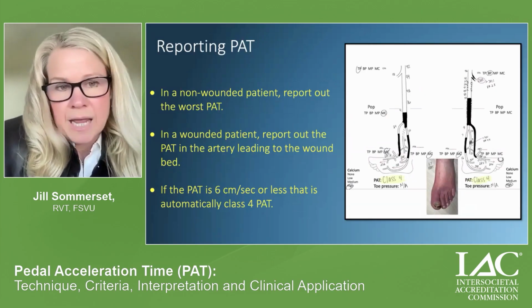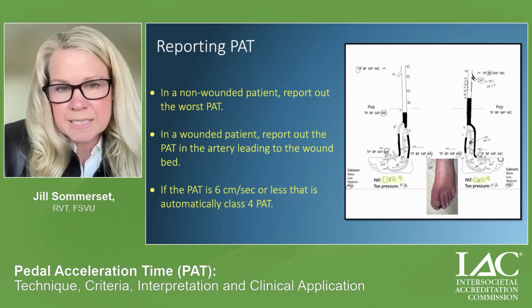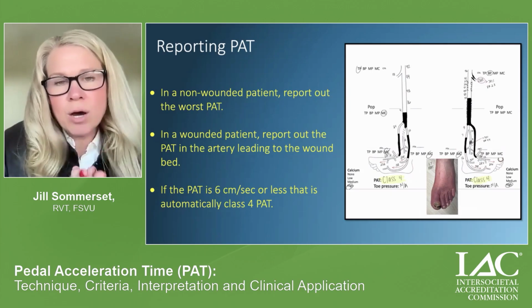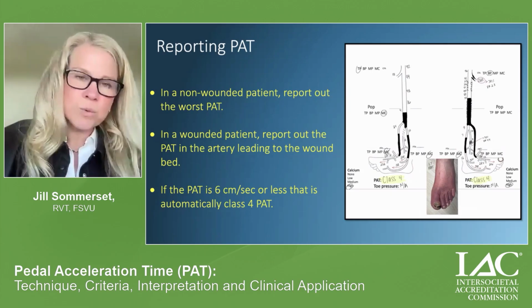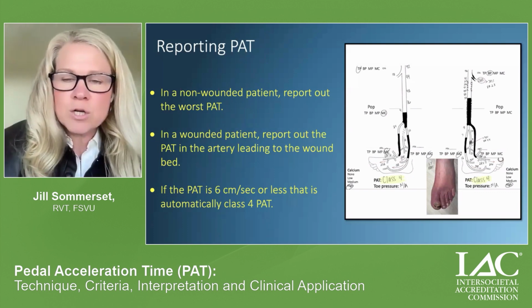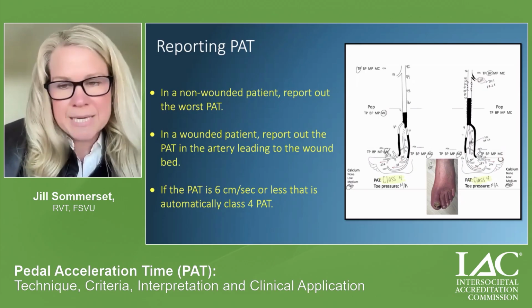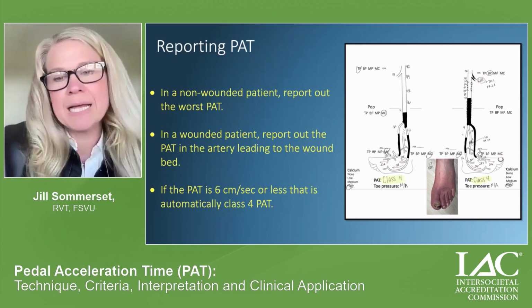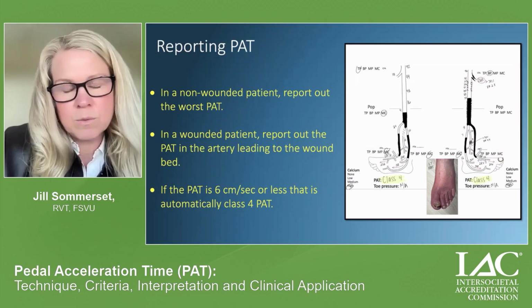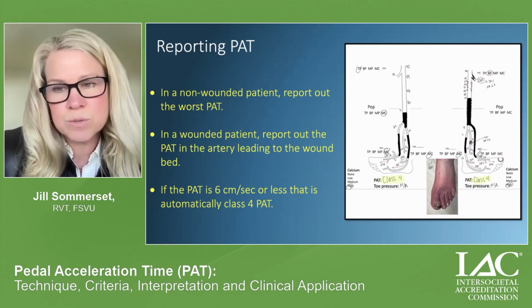This is a really important slide, and one of the most common questions is how do we report PAT? So I'm just going to take you through these bullet points. So in a non-wounded patient, maybe the patient has rest pain, maybe they have some foot pain, podiatry sent them for some reason. If you're going to do a pedal artery duplex, you want to report out the worst PAT in the pedal arch in a non-wounded patient. In a wounded patient, you would report out the pedal artery or the PAT leading to the wound bed.